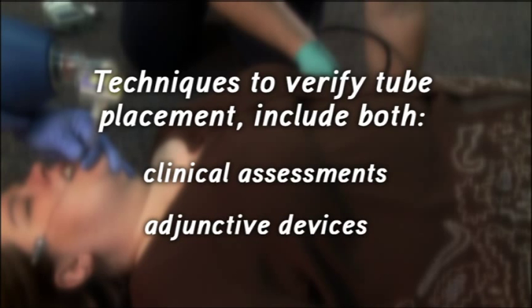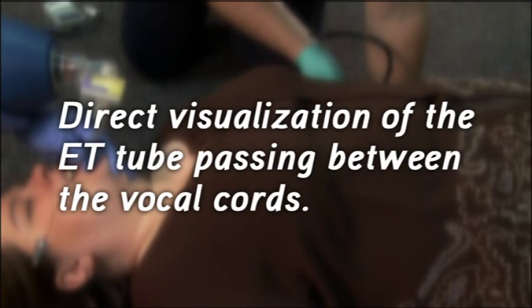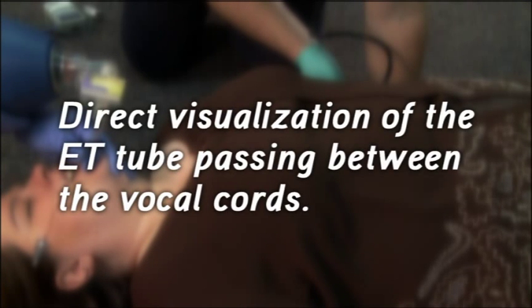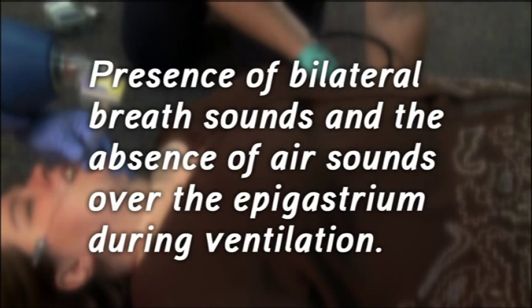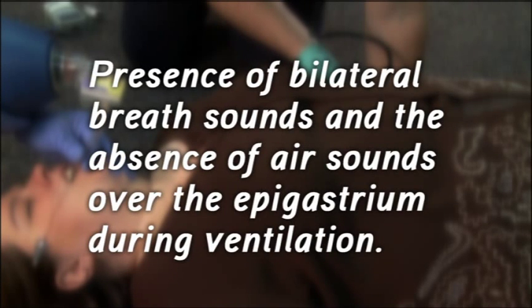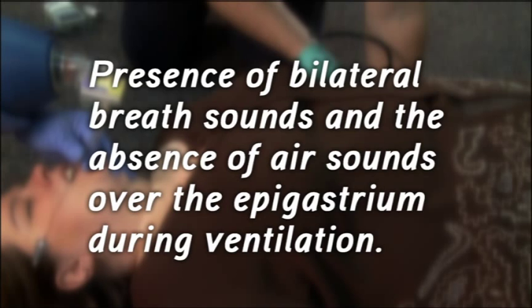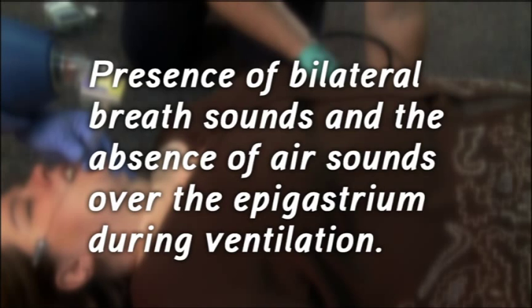Clinical assessments include the following: direct visualization of the ET tube passing between the vocal cords, and presence of bilateral breath sounds and the absence of air sounds over the epigastrium during ventilations.